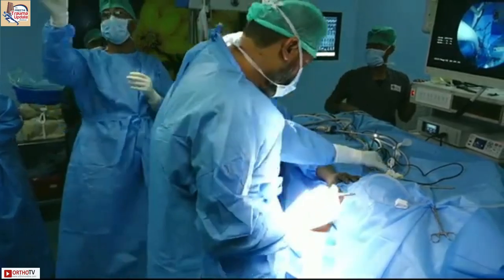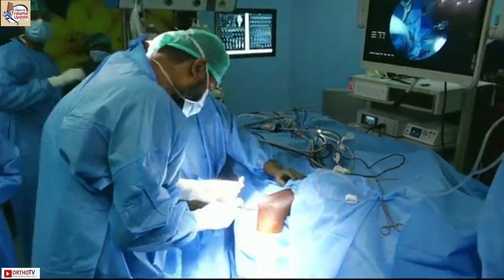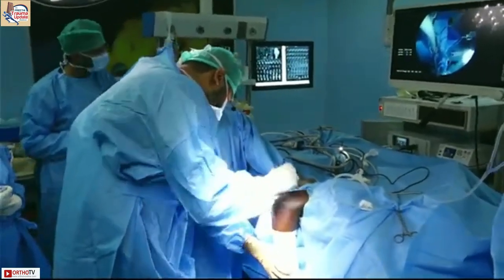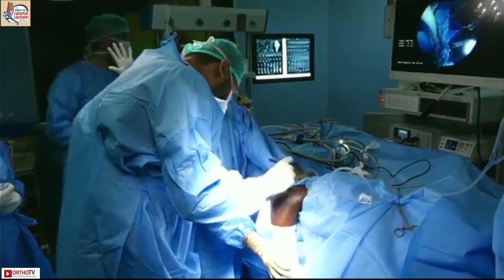In lateral decubitus position, and we're just going to mark. You can see the setup. We have the scope trolley on the opposite side of the elbow, and we're just doing the markings.